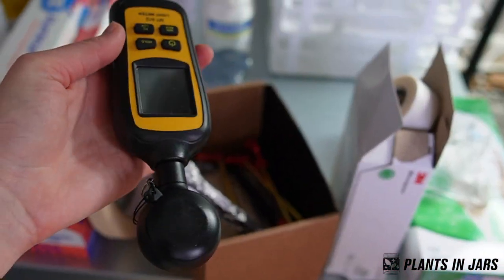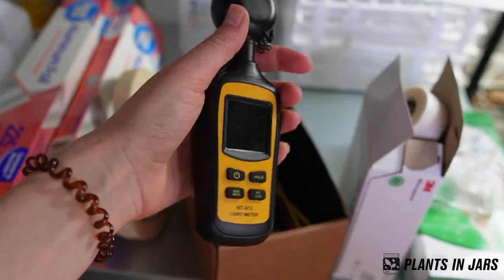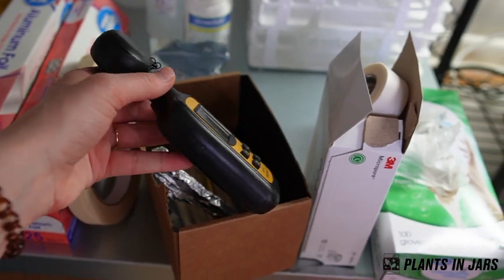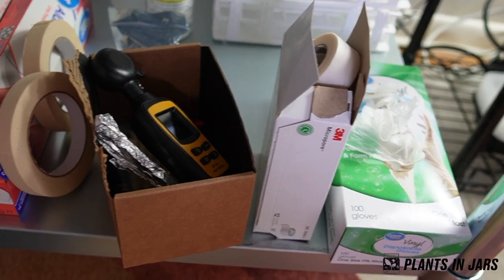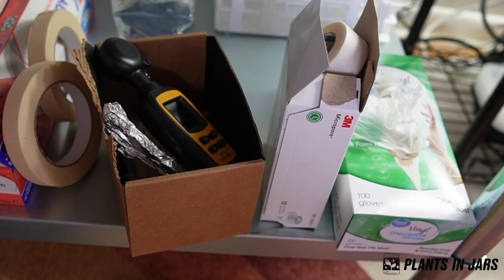There's so much random stuff in this box — a lighter, extra wicks for the alcohol lamp. This is a light meter. I love this thing. If you're not doing tissue culture and you just have plants, this is a super useful tool for trying to figure out if your plants are getting too much or too little light.